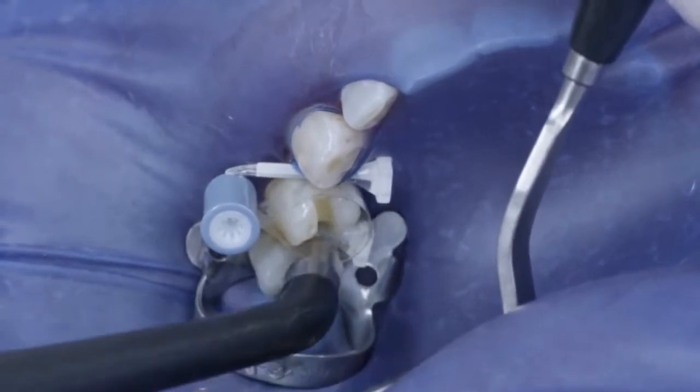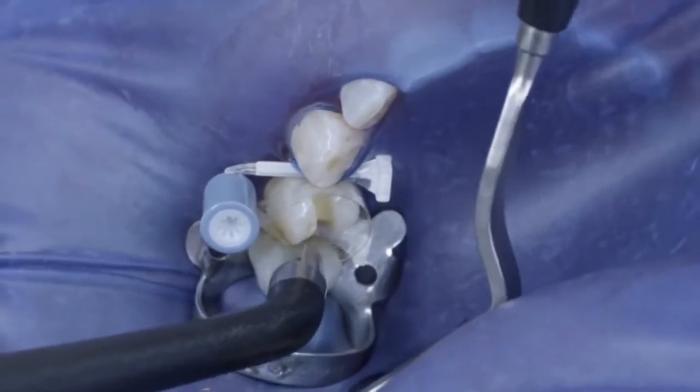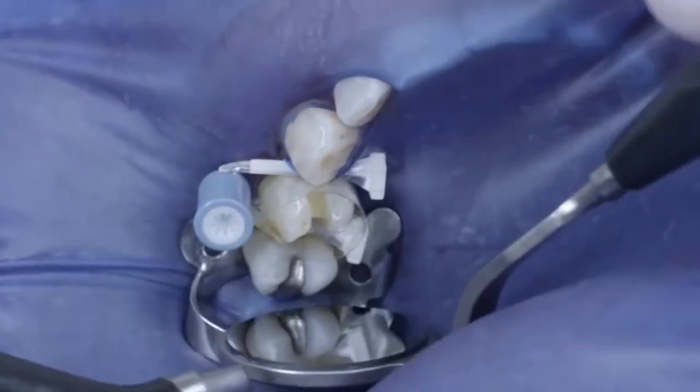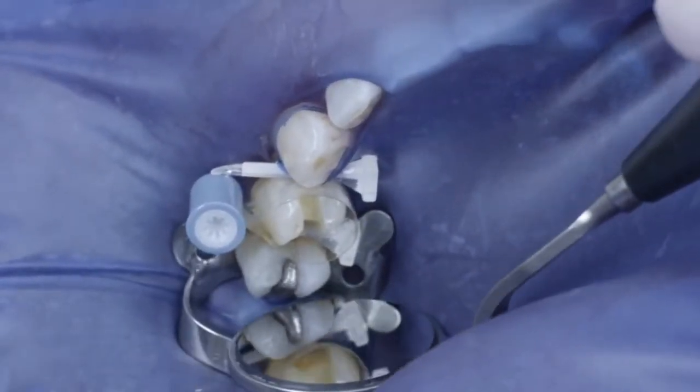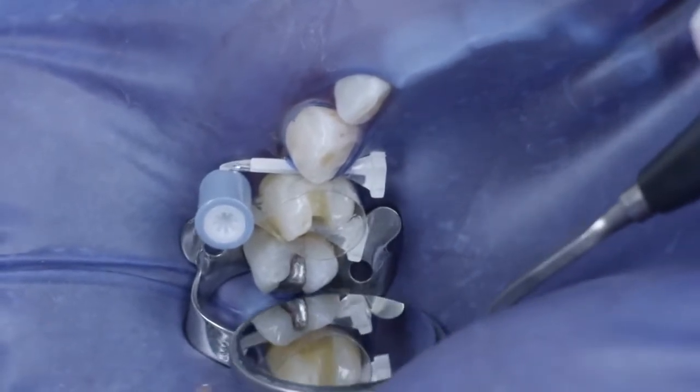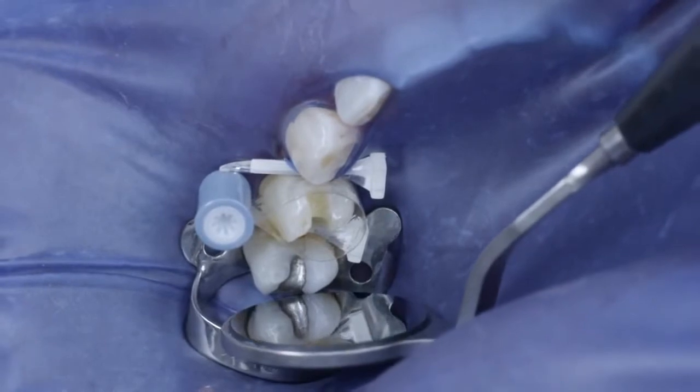Air was then blown onto the adhesive in a fanning movement, beginning in the proximal area and moving towards the center, and starting with a gentle current of air that becomes stronger towards the end. This was continued until the adhesive no longer moved and a nice glossy surface was achieved.